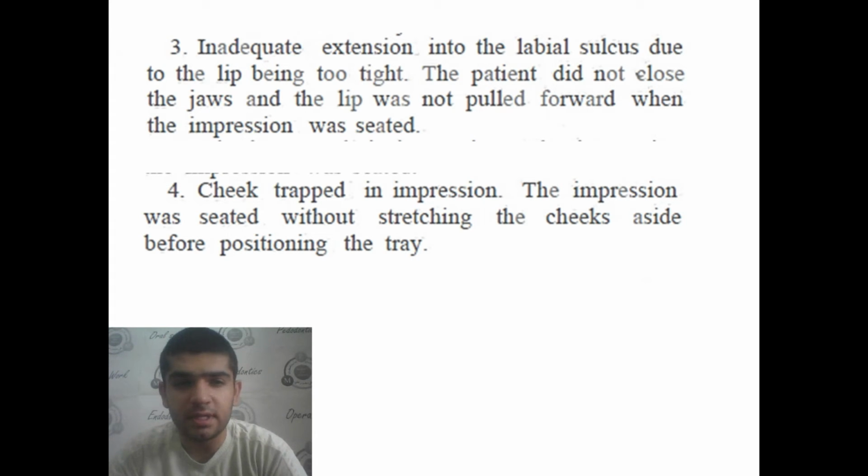The other fault is cheek trapped in impression. The impression was seated without stretching the cheeks aside before positioning the tray. So before positioning the tray into its final position, we have to retract the cheeks to prevent them from trapping under the impression.